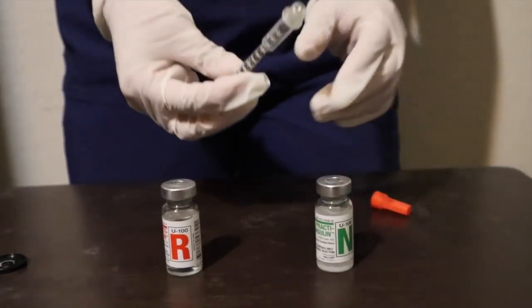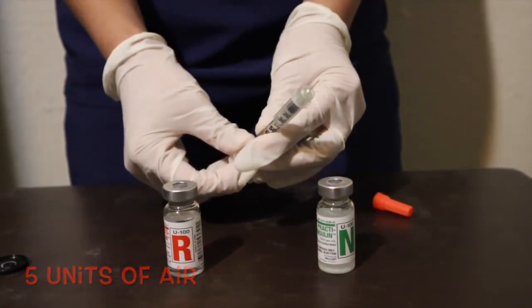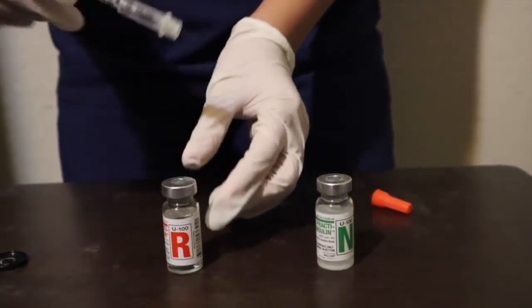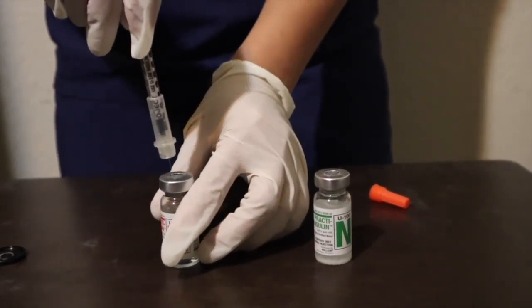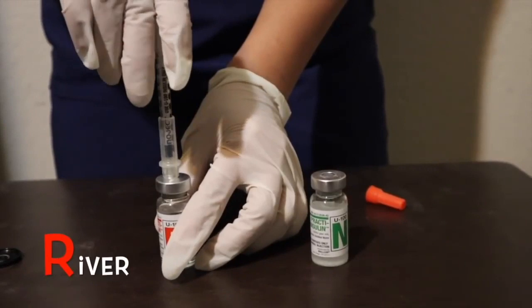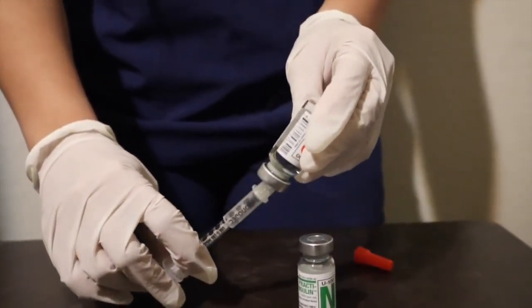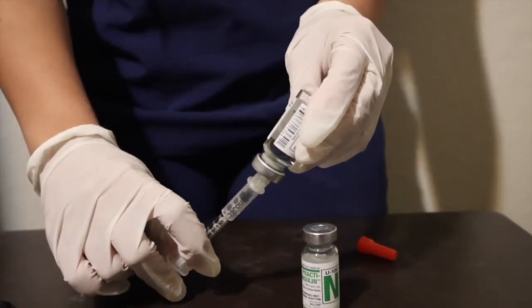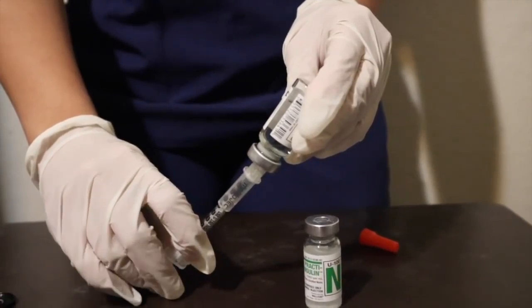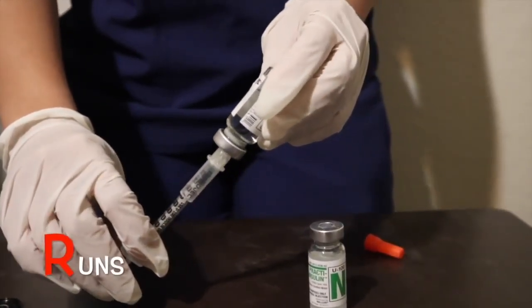Repeat the same: draw up five units of air and inject into my regular bottle. That is the R in the 'river' part. Don't pull out the needle. Instead, you are going to turn the regular vial upside down and actually pull up five units of humulin R insulin. That is the R in the 'run' part.